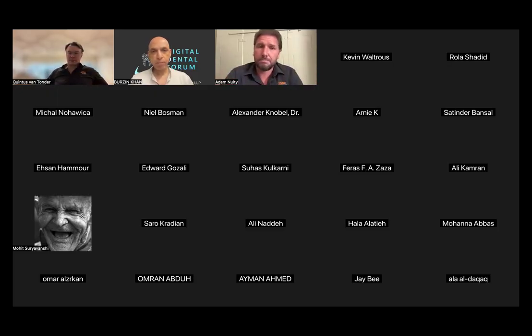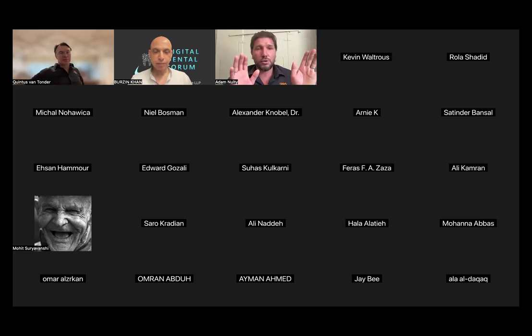That's the key. I think the question was more to do with the jaw tracking movement, the occlusal movement scan. Yeah. So you can still do all of those things, but you do that later when you've got the provisional in place, or do it separately and record that data with the provisional. It doesn't really matter. Don't get too worked up on which way round the workflow is. Don't get worked up whether it's separate cases. It really doesn't matter as long as there are common features to be able to match those data sets. Then you can bring in data from wherever.